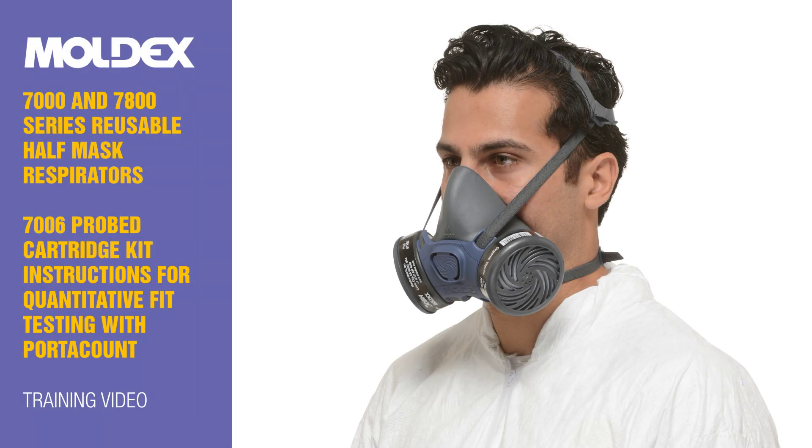Moldex 7000 and 7800 Series Reusable Half Mask Respirators — 7006 Probed Cartridge Kit Instructions for Quantitative Fit Testing with PortaCount. Training Video.